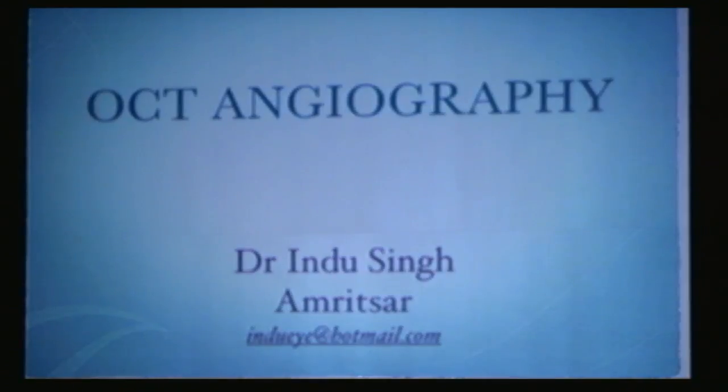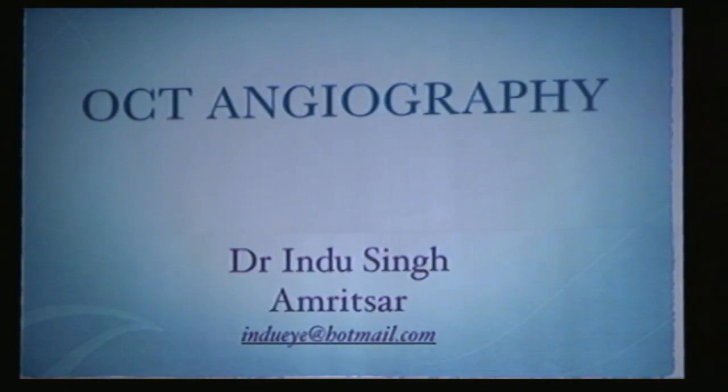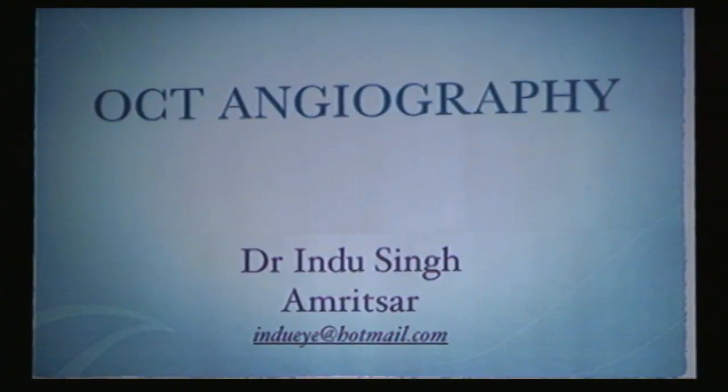So I wanted to put up this slide, which is an important marker in chronic central serous. If you notice this area, which is under the neurosensory retina, this is usually seen in progressive chronic CSR, with elongation of the photoreceptor outer segment.